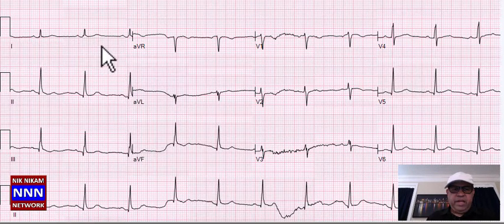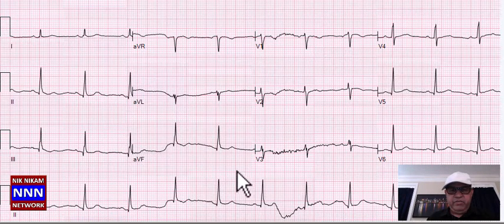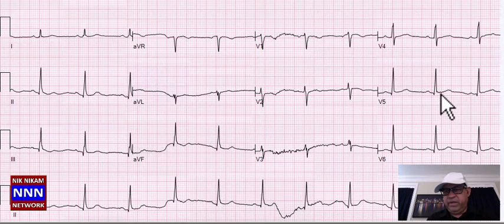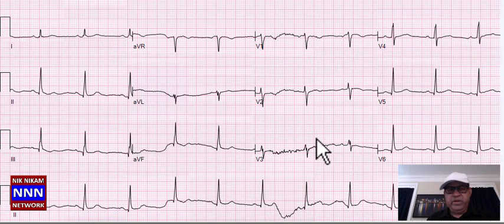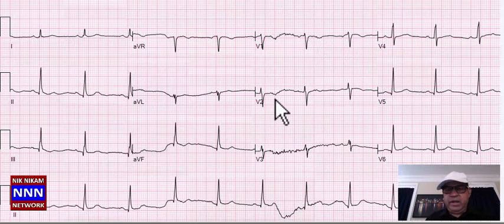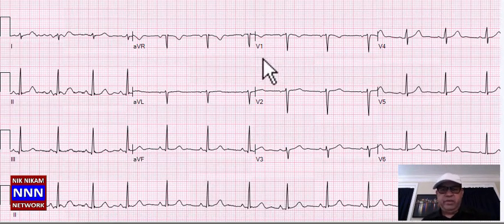Again we have sinus rhythm with non-specific ST-T changes in the inferior leads. In anterior leads, T-wave changes. Laterally, ST segments are a little bit elevated with flat to negative T-waves. This is an abnormal electrocardiogram with non-specific ST-T changes.